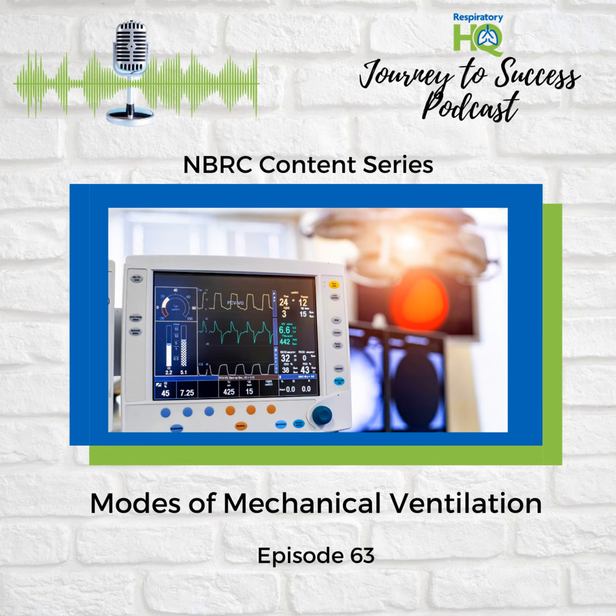Lung compliance. I'm not familiar with that term. It's essentially how easily the lungs inflate. Think of it like a balloon. A stiff balloon has low compliance. It takes more effort to inflate it. On the other hand, a balloon that inflates easily has high compliance.